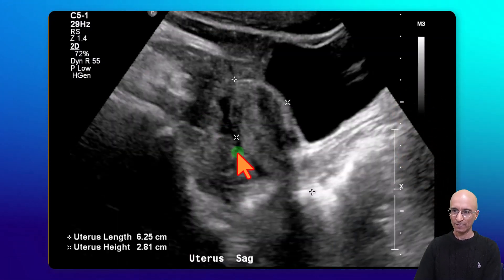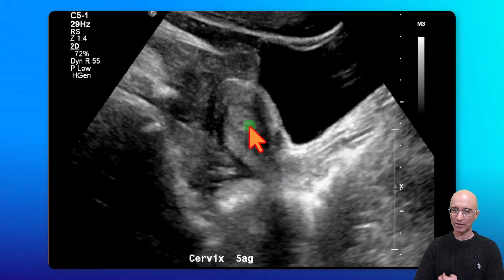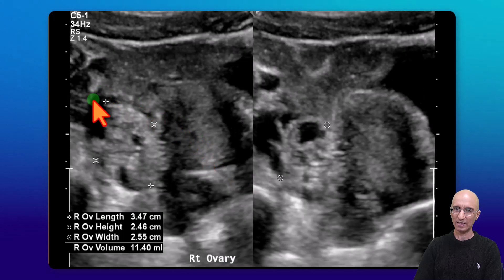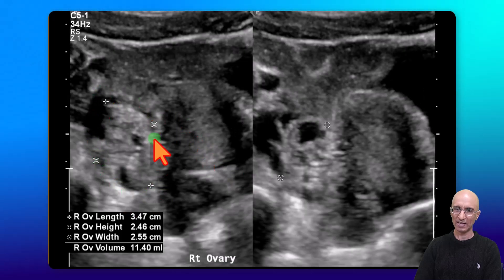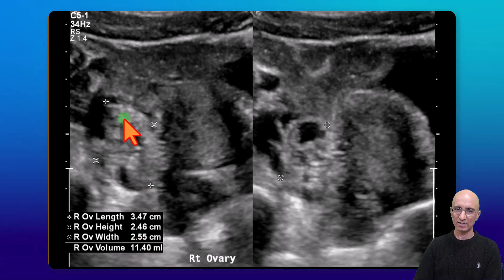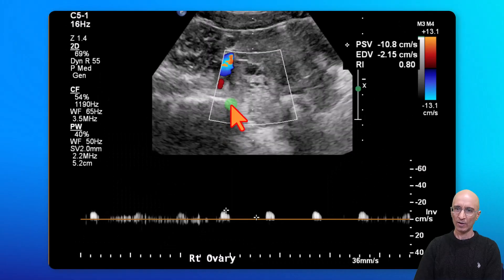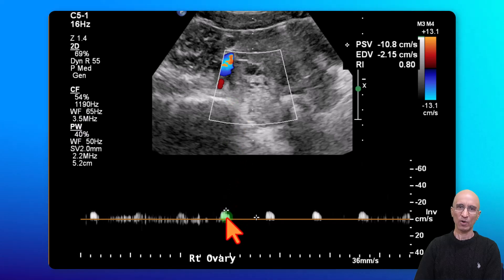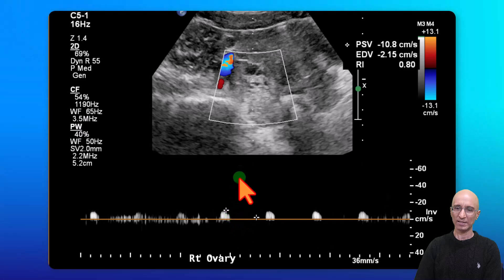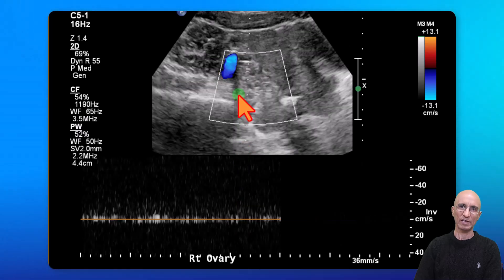On the ultrasound we can see a normal appearing uterus and the endometrial stripe. As I continue to scroll through the images, we can see the right ovary which appears slightly enlarged. The central stroma of the ovary appears slightly echogenic. On the spectral Doppler evaluation, a small amount of arterial flow is seen but no diastolic flow is identified, and no definite venous flow is seen.